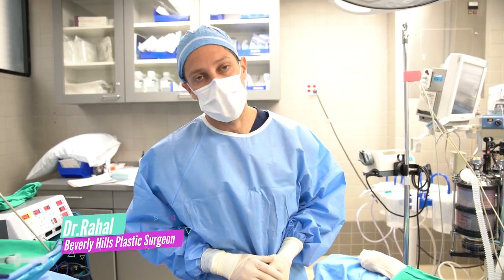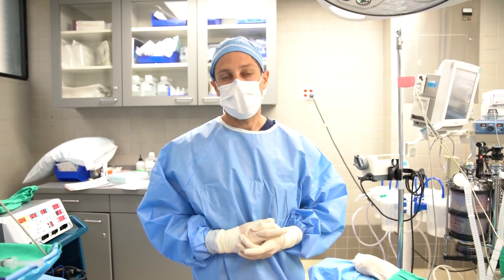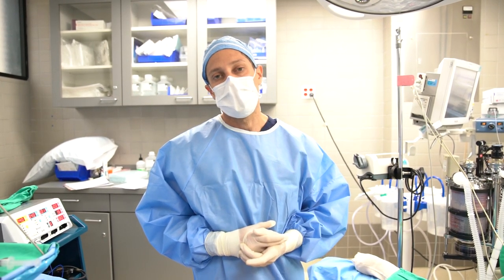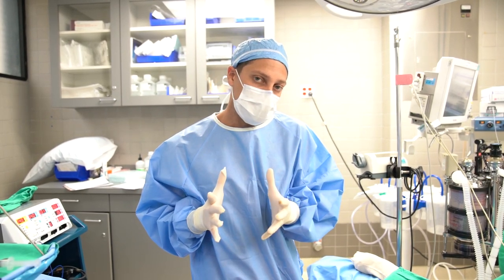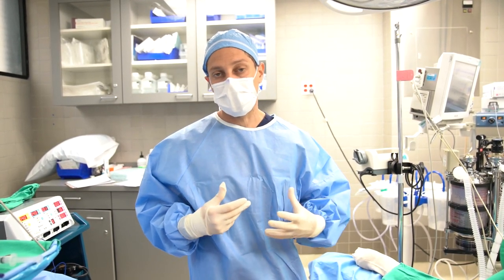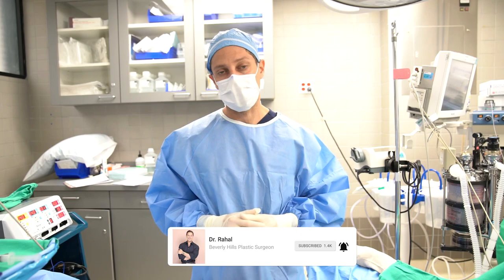Hi Dr. Rahal, it's Monday, we're in the operating room this morning. We have a 360 lipo BBL procedure and we're also going to be doing J plasma. This patient is in her 30s, about 5'5" and 160 pounds. You're going to see a very dramatic transformation in how tight I get her waist and how flared I get her hips. She wants a waist-to-hip ratio of approximately 0.6, something we cover in consultation, and we'll be showing you during surgery how we accomplish those dramatic ratios.